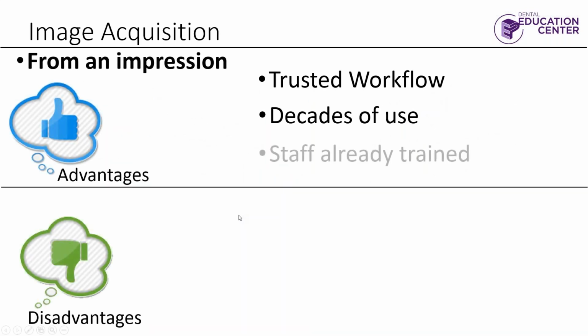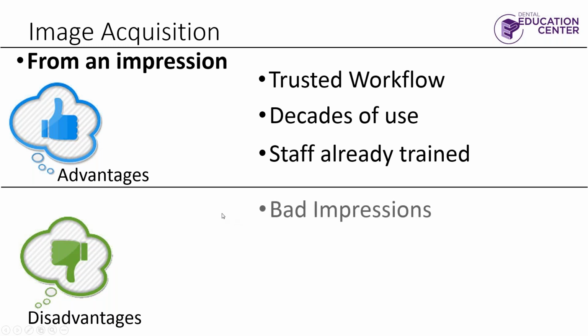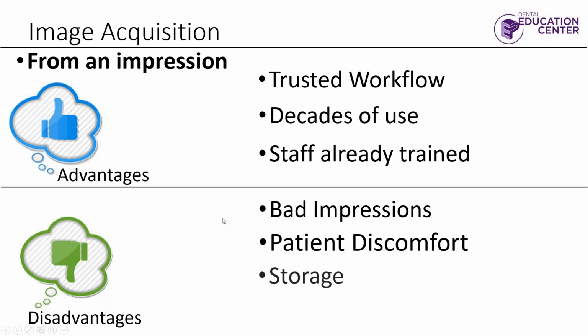Like I said, some of the advantages of impressions: you've been doing this for a long time, you've been taking impressions forever, your staff is already trained. Some of the disadvantages, and I think we did talk about this already, is a bad impression, the patient sitting there with a whole mouthful of impression material. Where do I store all this stuff? Do I have to store it?